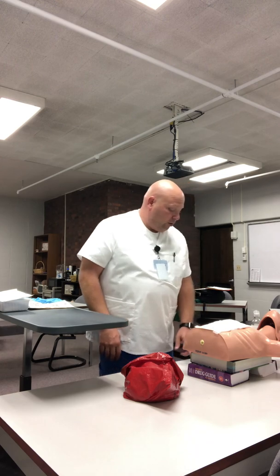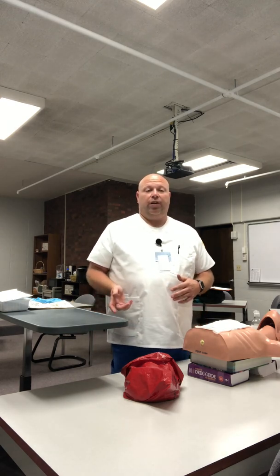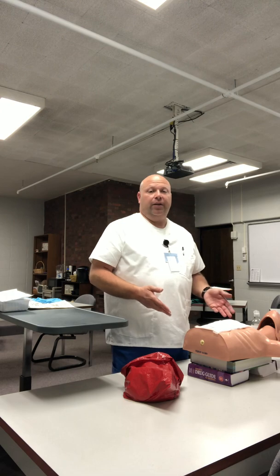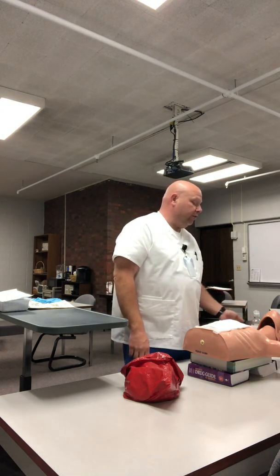Perfect, Mr. Smith. So I have identified Mr. Smith by his name and date of birth and by his wristband. I've also checked the chart prior to coming in about this dressing. Do you have any allergies? No allergies.